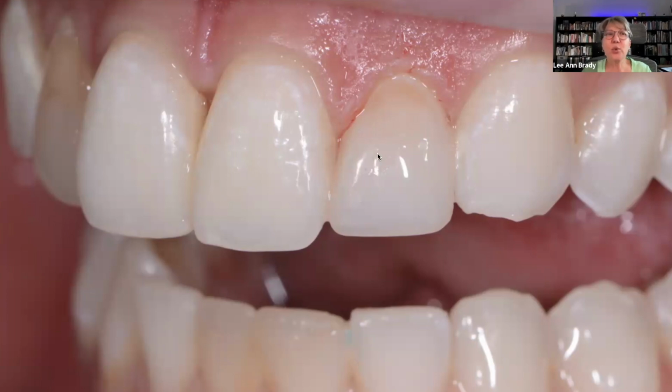Okay. So, do I do that with all those different steps and all of that complexity in every anterior composite? No, because not every natural tooth really requires that. But I figure it out again by using my recipe. I knew what color composites I was going to use. I chose them. I had them already out, how many different layers I was going to need to do. And I did it by matching it on her other central before I ever did anything else.